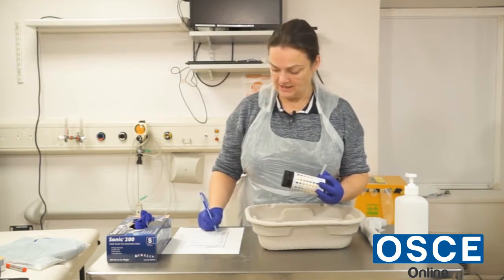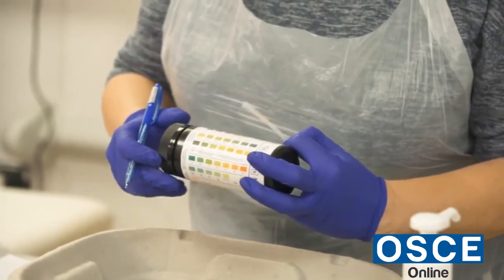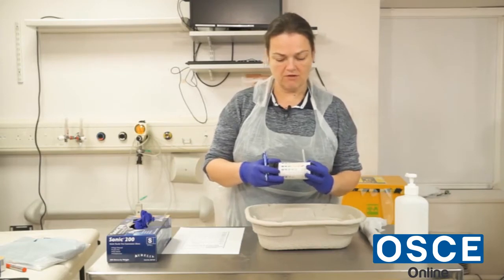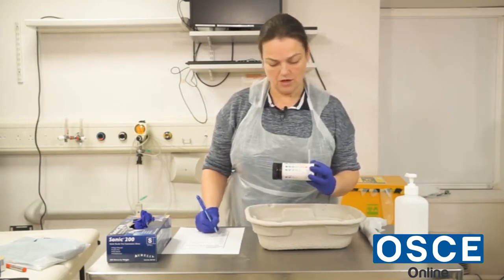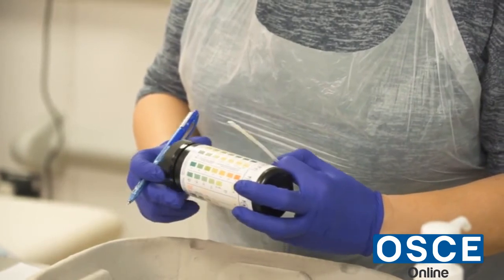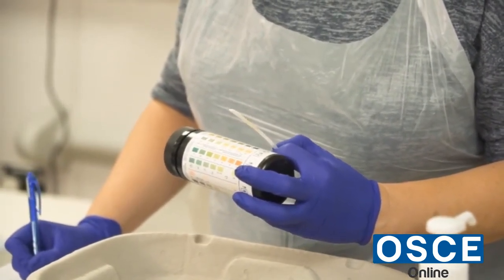So I'm going to put a tick in the negative box. 40 seconds is gone, and the ketones is showing a trace. So I'm going to put a tick in the trace box. Specific gravity is not showing much, but it's showing a little bit. So I have to match the colour up. The colour's coming out as third box along. So I'm going to put a tick there, and that's 45 seconds.